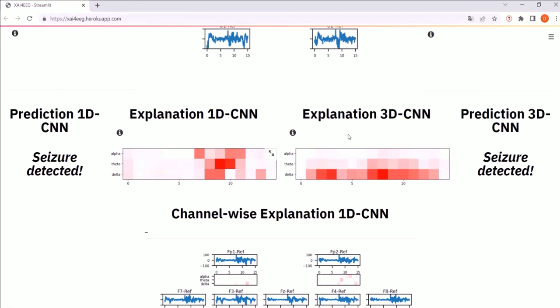This constitutes an advantage of our hybrid seizure detection approach that incorporates an identical visual explanation schema, where one learning module may miss to capture and therefore to present decision-relevant factors, while the other learning module does and therefore augments the overall explanation. In addition, this constitutes a way for evaluating an explanation.